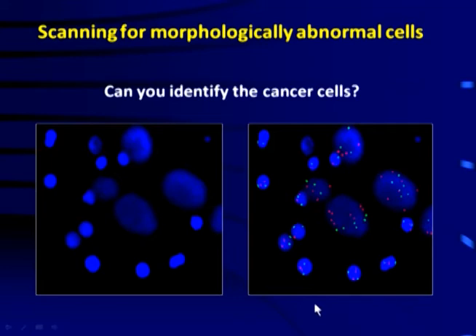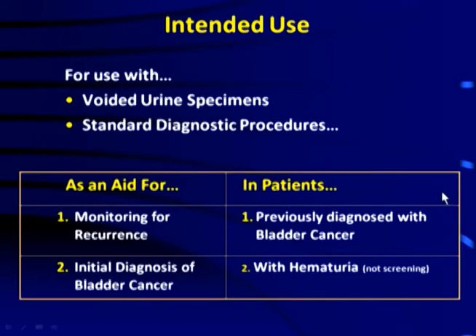So that's why we're very comfortable. UroVision is our highest volume FISH test. We do no less than 300 of these a month, and on a busy month we may do 500 or 600 of these. Every single one, again, on the robotic or automated spot counters. And again, we're very comfortable that the concordance with the human eye is 100%. This is the FDA requirements, or the intended uses.